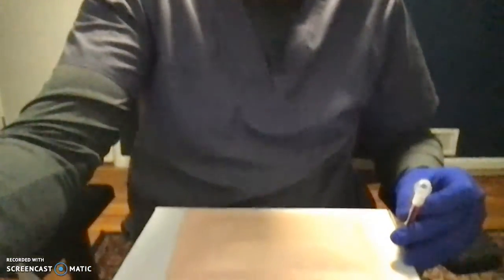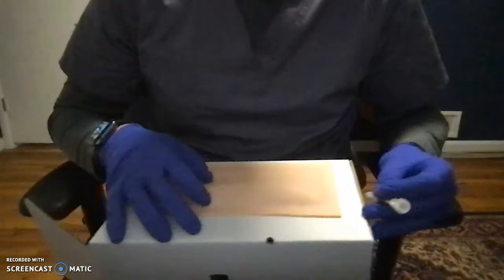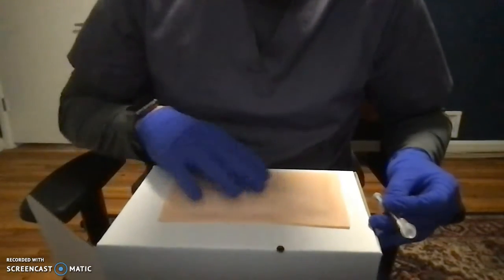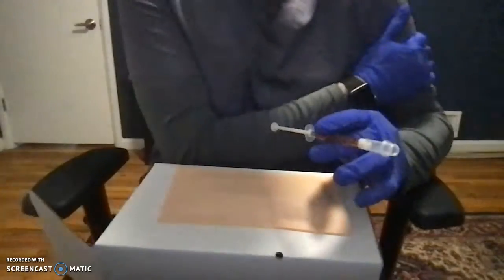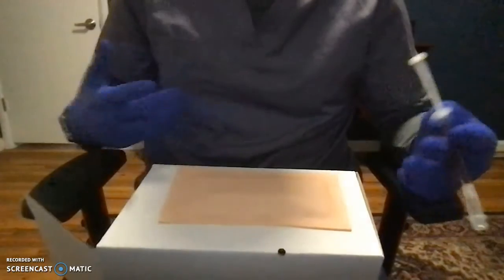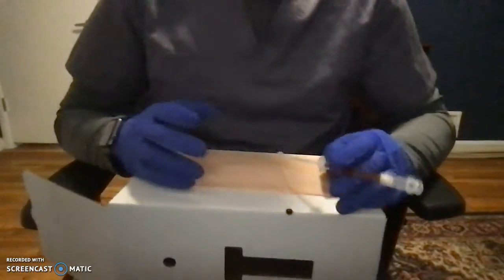So what we're going to do is we're going to take our patient here, and put this down a little bit. Okay. So we're going to want to inspect the skin. We want to make sure there's no bruises, inflammation, edema, anything like that. Normally for subcutaneous injections, we're going to be looking at the lower stomach, or the arms or the legs. But for the purpose of this, we'll say that it's in the stomach. It's an easier place to do it. It's kind of recommended for that.